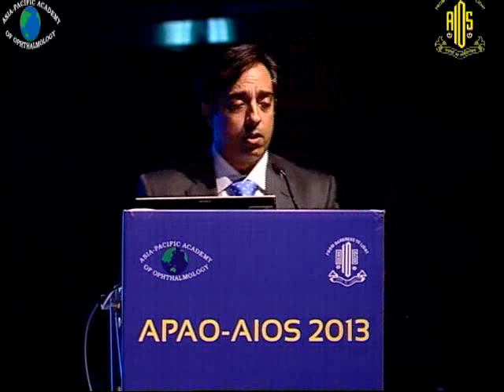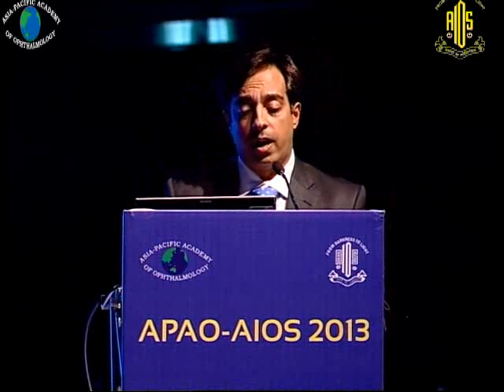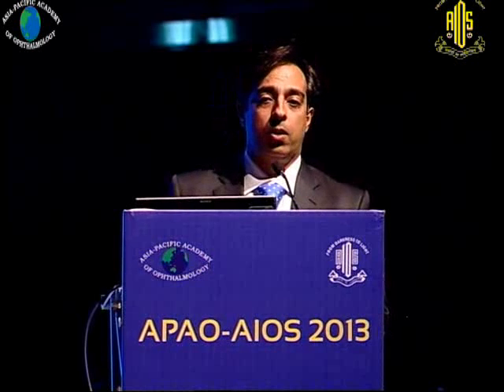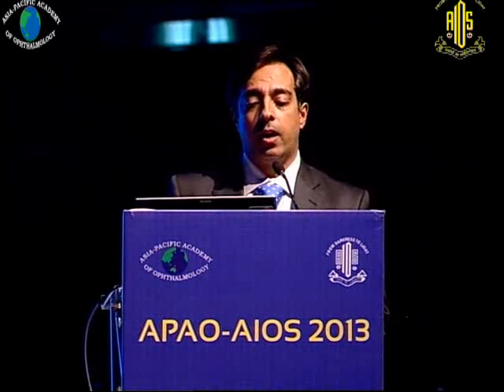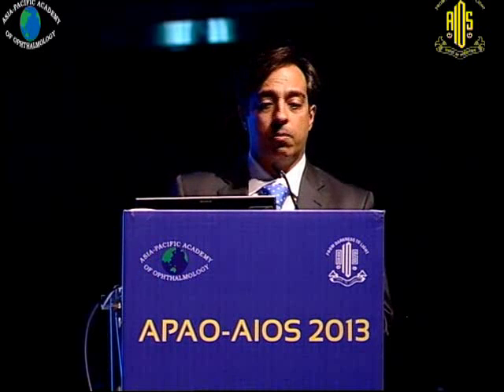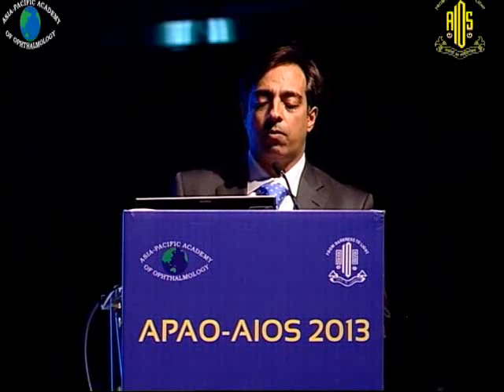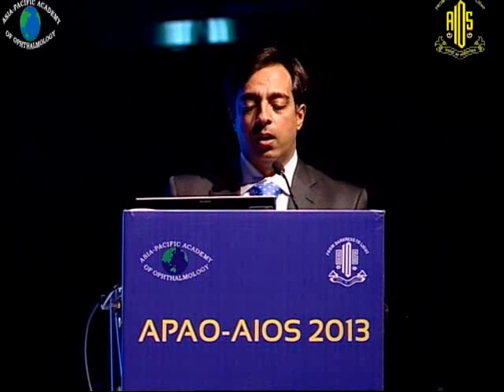Young patients with foreign bodies inside, before you approach the foreign body, it's always a good idea to remove the hyaloid, which you can see, because these cases are notorious for going into PVR changes, because we are very happy removing the foreign body. You just go in and slightly loosen it, take a magnet, remove it, but then what you leave behind is the whole vitreous, and within a month the patient would come back to you with a detachment or already a PVR change taking place. So here you can see that as we remove the hyaloid, the foreign body loosens up, and then later on you can remove it and take care of whatever damage it's done eventually below.